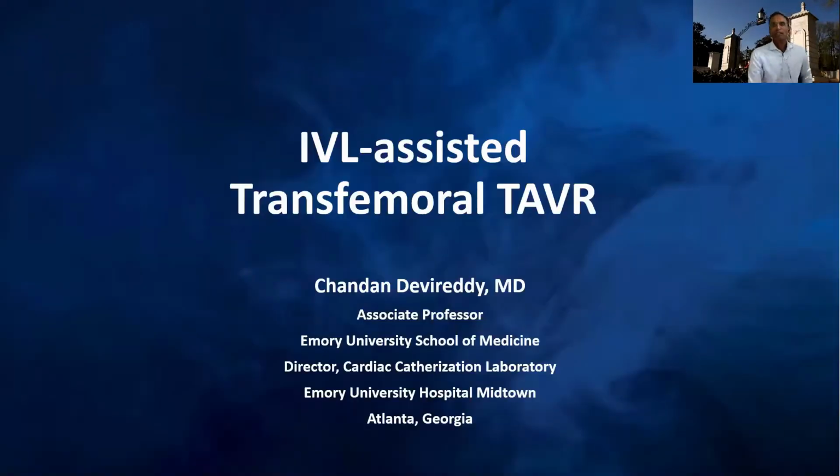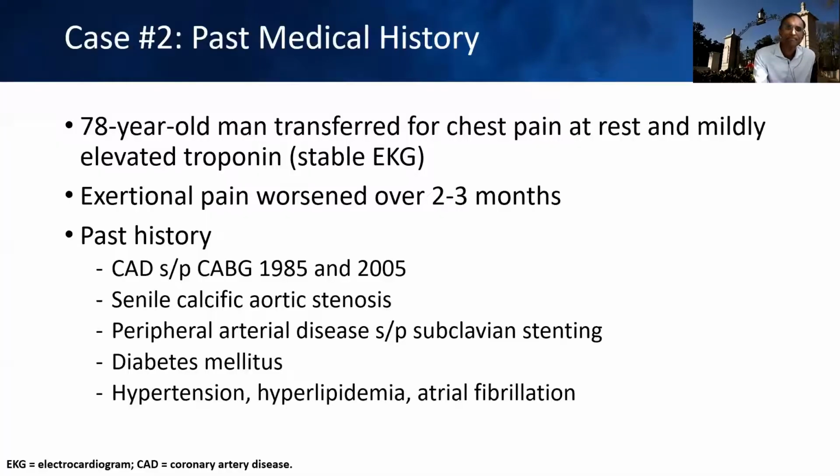Trying to maintain the overall workflow and logistics of transfemoral TAVR, however, has been greatly facilitated with the technology of intravascular lithotripsy. A case where I'll try to highlight the use of this technology is in this 78-year-old gentleman who was transferred to us for a history of unstable angina.